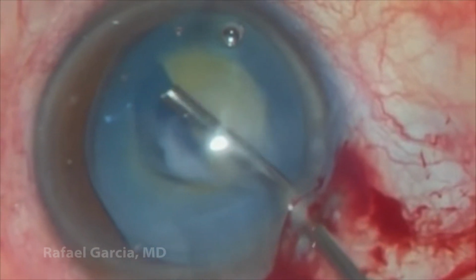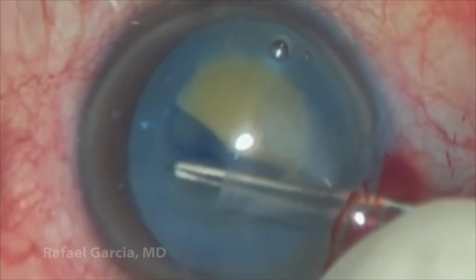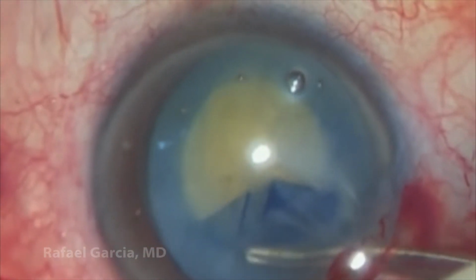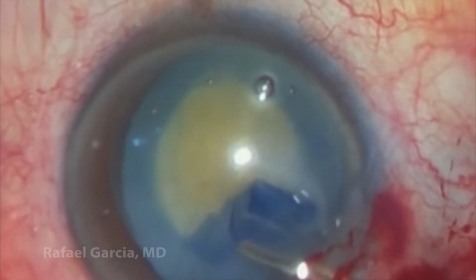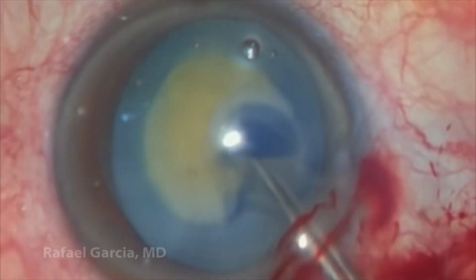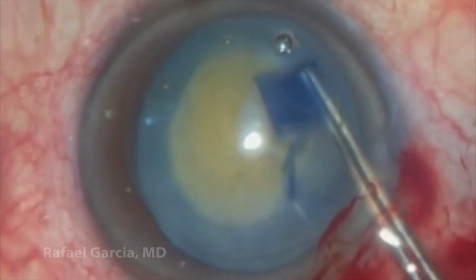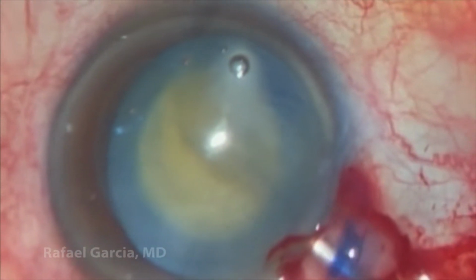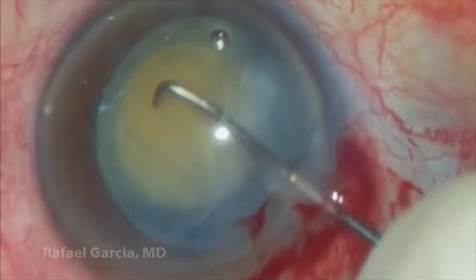Using Utrata forceps, we complete the capsulorhexis, always paying attention in keeping the anterior chamber well formed and pressurized. Whenever needed, more viscoelastic is injected in the AC. This way, the pressures are balanced and the capsulorhexis won't run away. Once we are finished with our capsulorhexis, the nucleus is easily rotated.